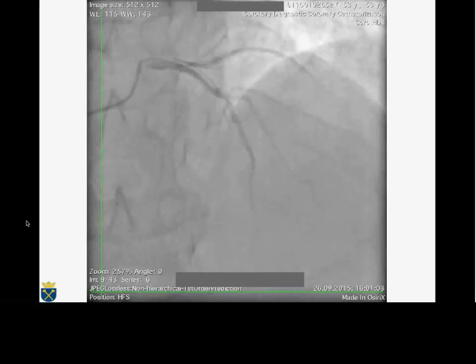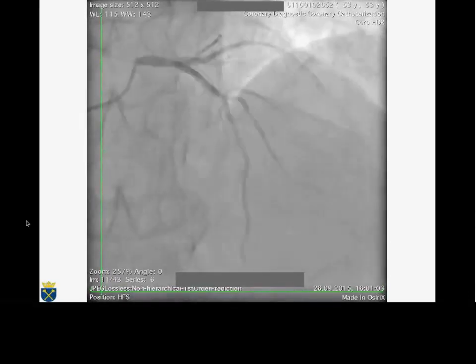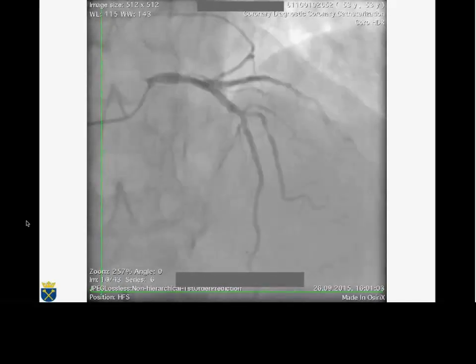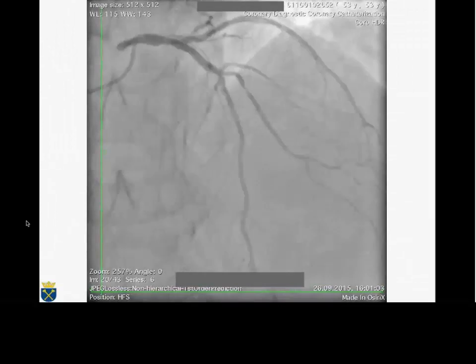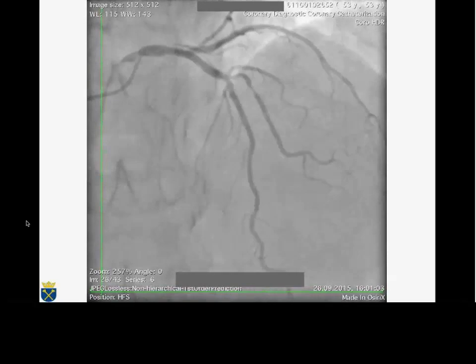And now there's some paradox that people who are doing regular angioplasty have, during a complex procedure, a higher radiation dose than we have during a complex CTO procedure, because they don't think about this. Everybody thinks that you should remember about the radiation during the CTO, but the majority of our colleagues don't remember to think about the radiation during normal, regular angioplasty.